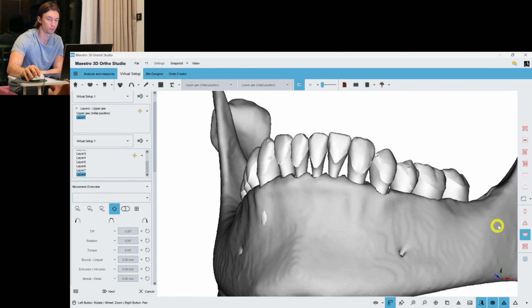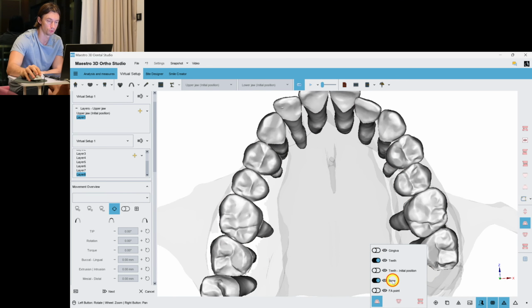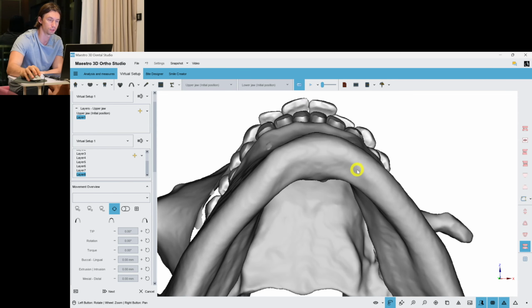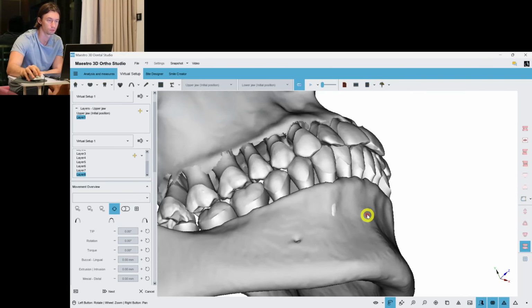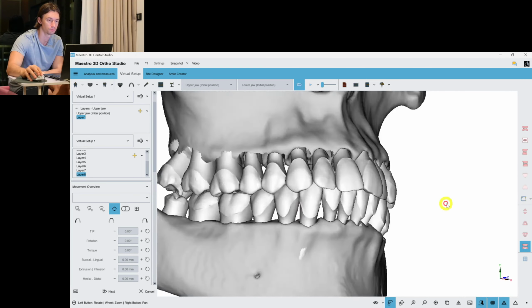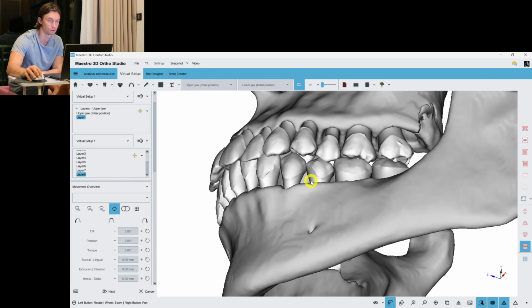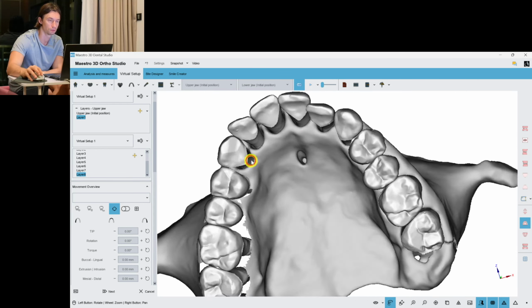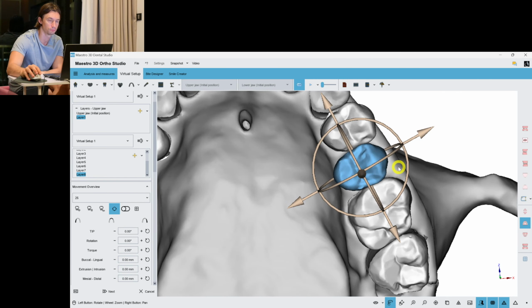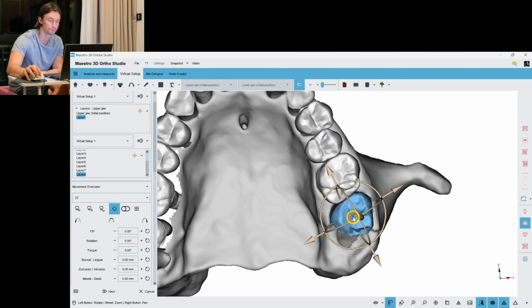And now we will make the upper jaw. Remove the gingiva, turn the bone on, and make some distalization. Here. It will improve the contacts. And we'll get some more space to put this second premolar more buccally.